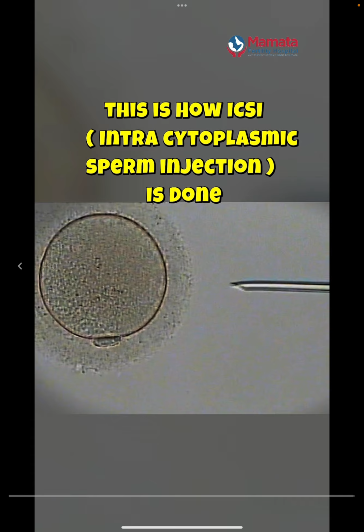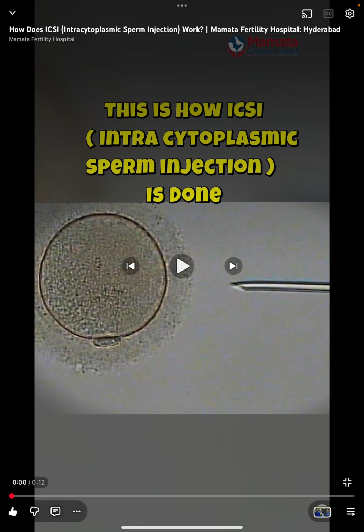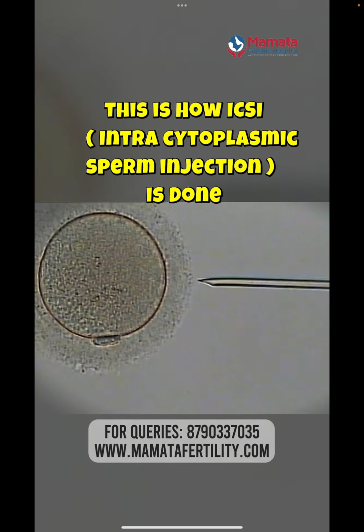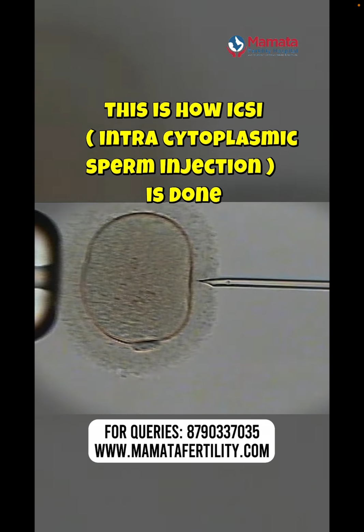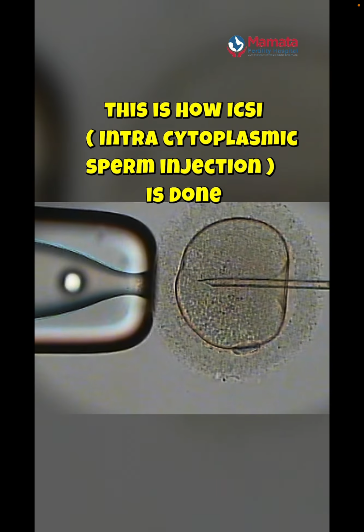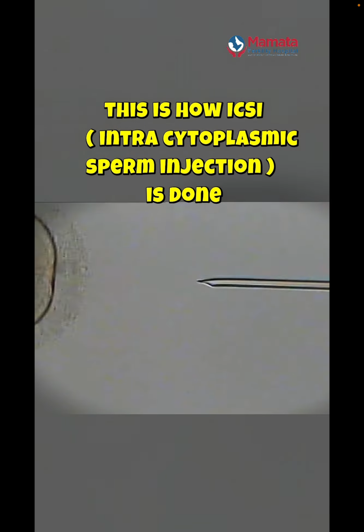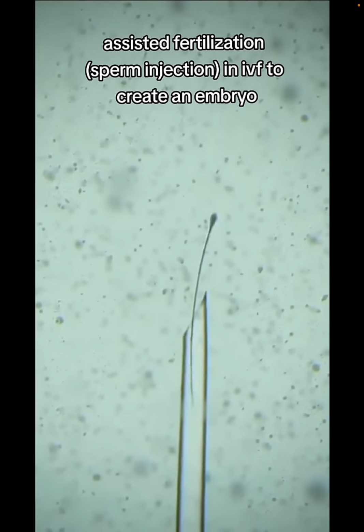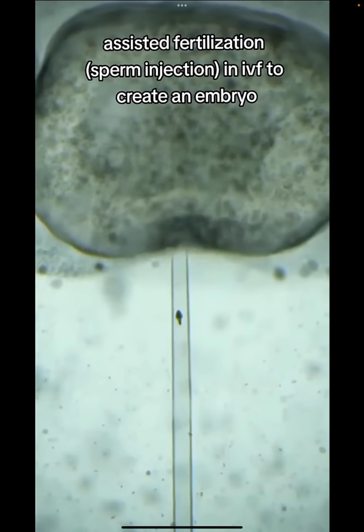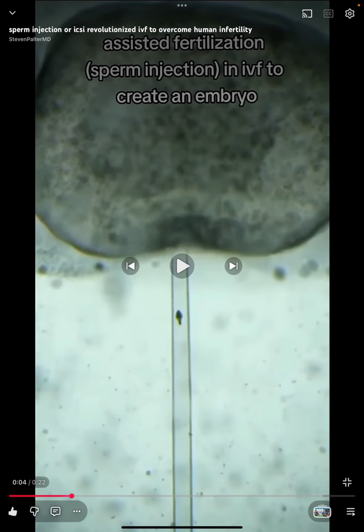And if you properly see, once the injecting needle is inserted into the cytoplasm, a gush of ooplasm enters into the needle. If you look properly, you can find out. See, the sperm is bent backside. See, a gush of ooplasm is there. Then the sperm is being injected. This is ICSI. Okay, this is also the same ICSI, where the sperm is being injected.